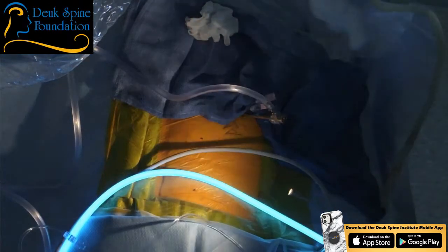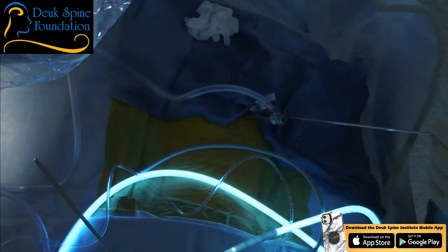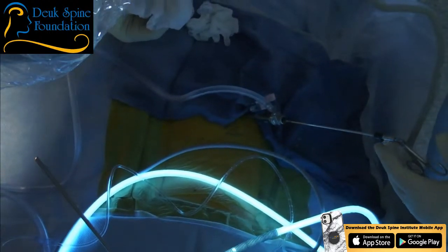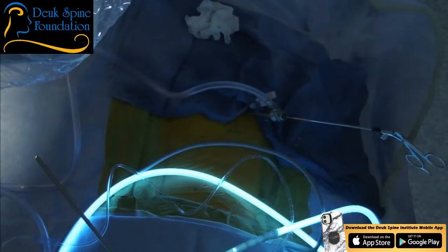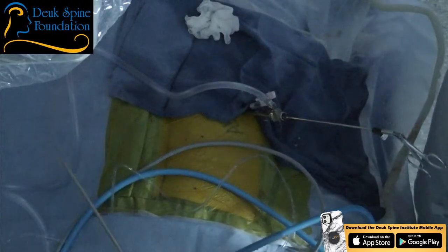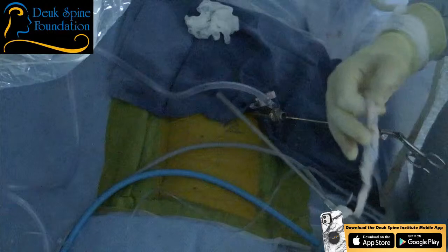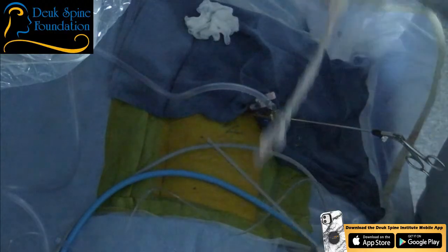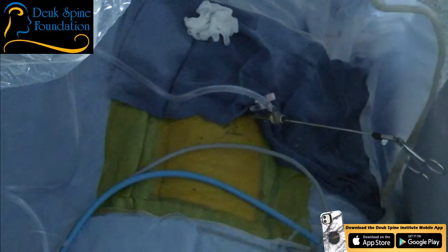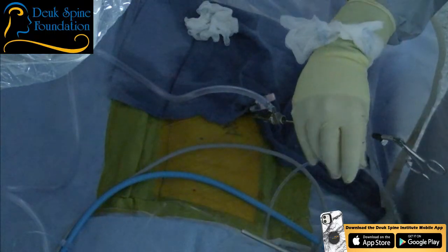All right, we're just going to take a minute here. Let's see if we can stop a little of this venous ooze. The bleeding we're getting is like literally minuscule drops of blood. It's nothing. It's nothing in terms of blood loss for the patient, but it's obscuring a little my view, which I still know how to do the surgery even with a little bit of bleeding like that. So it's not a concern in terms of blood loss or my capability, but I want to be able to see clearer. So we're going to take a minute.